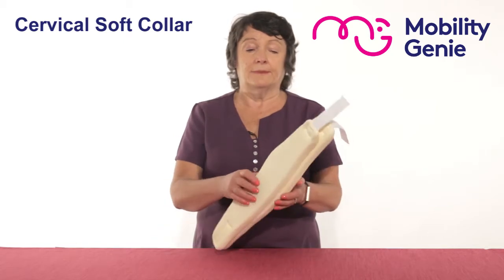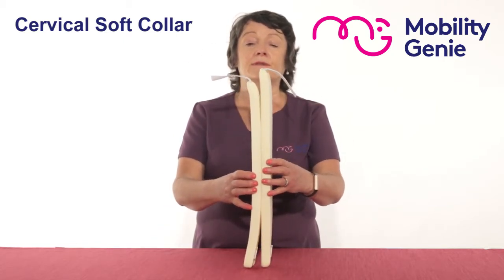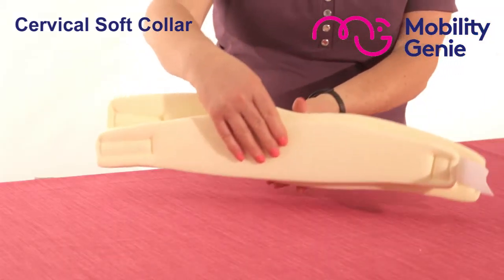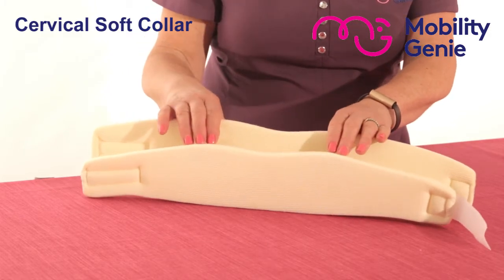When I put one collar beside the other you'll see the difference in length, and when I put one collar in front of the other you'll see the difference in depth.